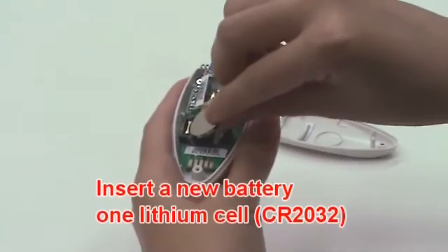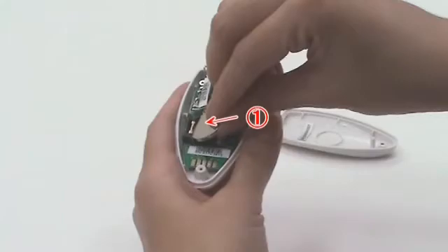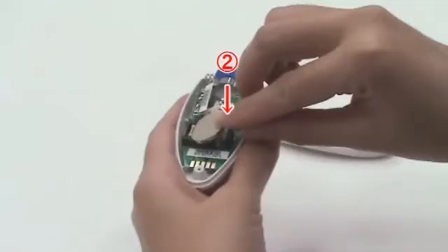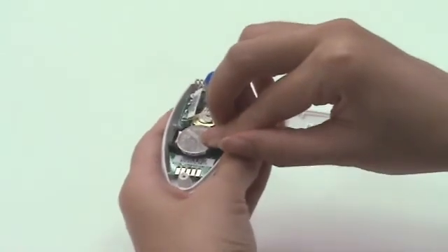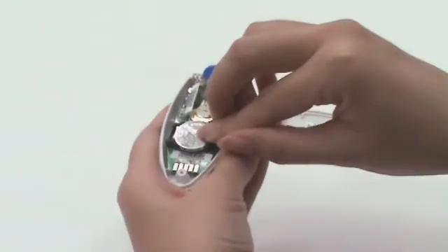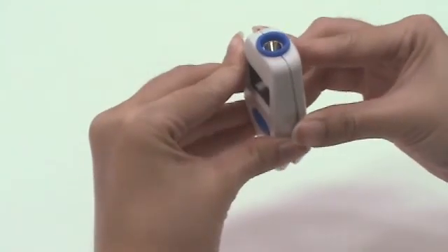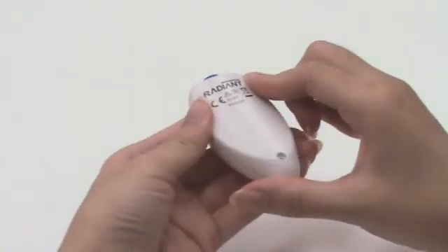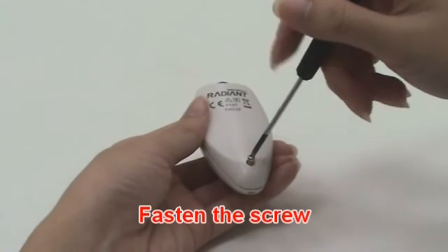Insert the new battery under the metal hook on the left side, then press the right side of the battery down until you hear a click sound. Close the upper side and then the bottom side, and fasten the screw on the back housing.